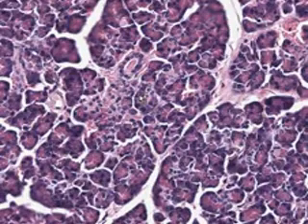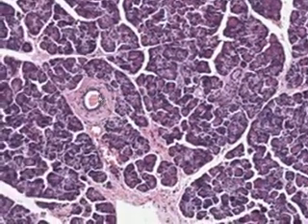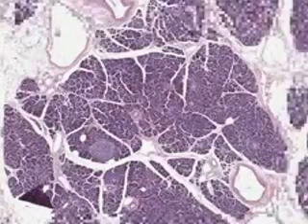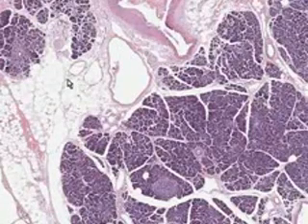And you might also call this type of intralobular duct perhaps an intercalated duct as well, if you're a big stickler and using beautiful words. Otherwise, let's just call it intralobular. And let's call all the ducts that we see between the lobules as interlobular or extralobular. And notice also the pancreas has a good amount of fat in it as well. There's fat there, there's fat there.